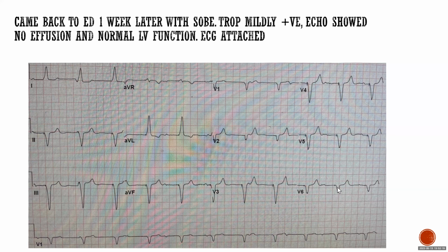That's fine. But there are no P waves preceding each QRS. In fact, there is no association. This is a P, a P here, then here. They're just completely random. So the ventricle is fine, but now it's not sensing the atrial activity.